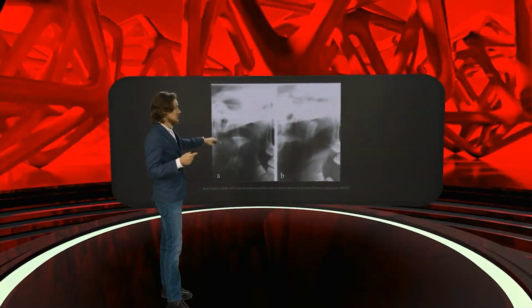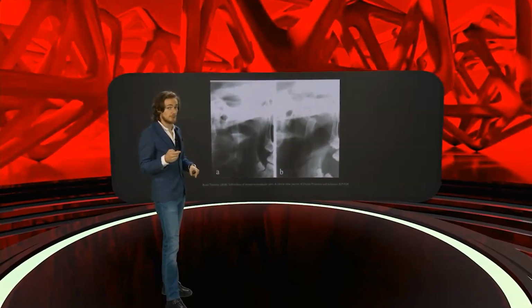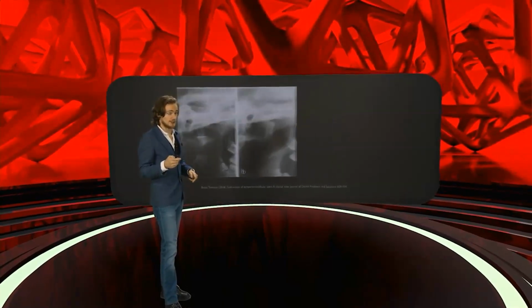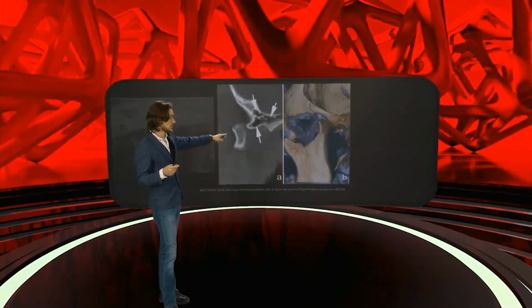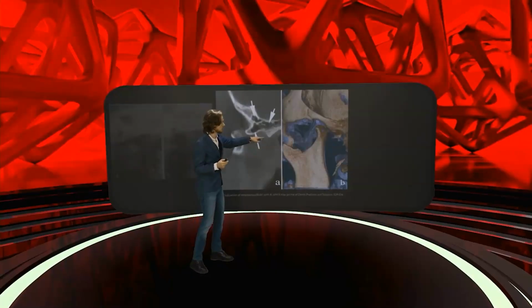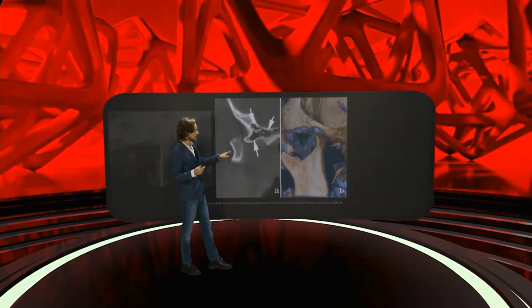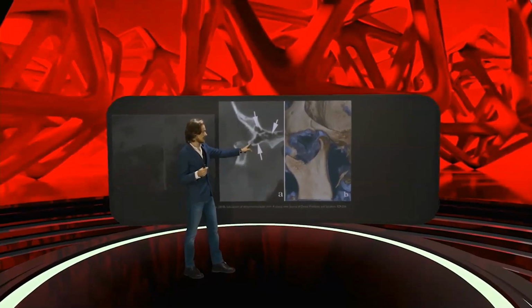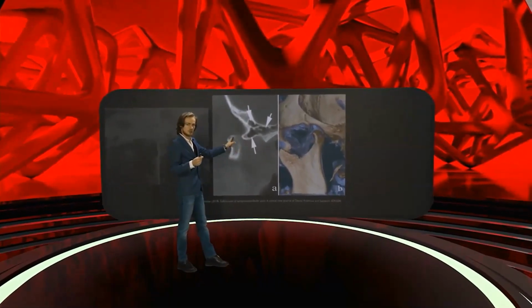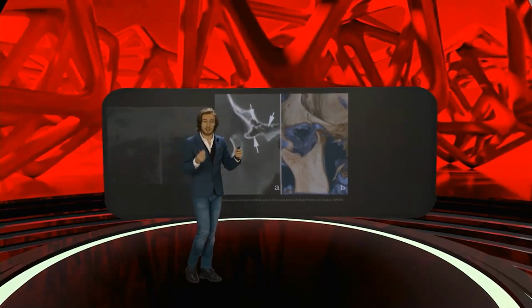And this picture is a picture of the hypermobile joint, and it was only 2D. In here, you got a 3D picture. So let's take a look what you got. This is the fossa in here, and this is the condyle. So the condyle should stop in this position. So it goes too much forward. So this is subluxation or luxation if the patient cannot come back.